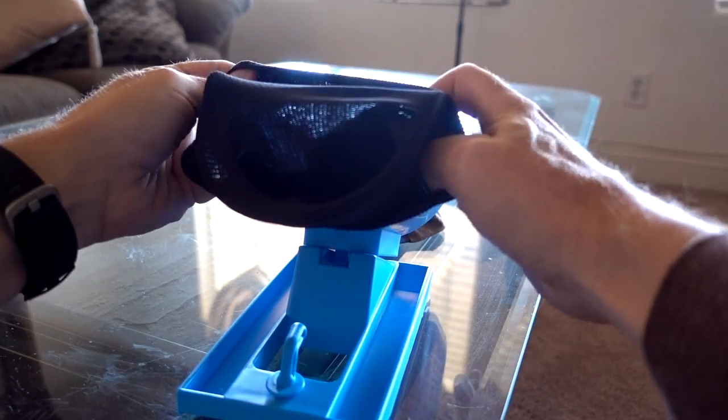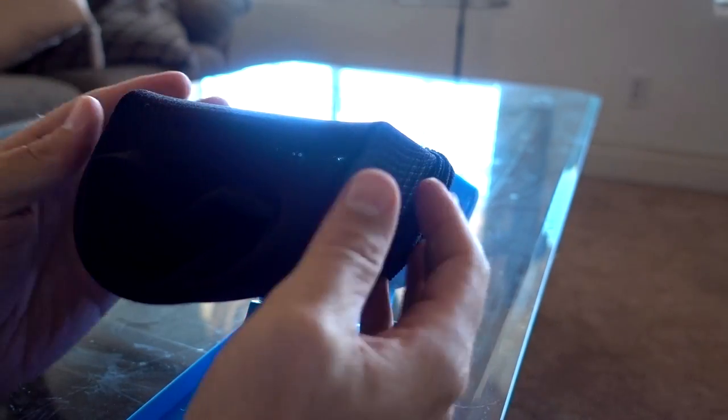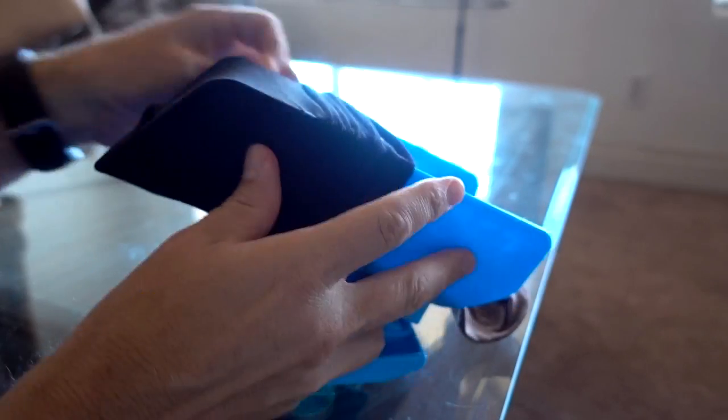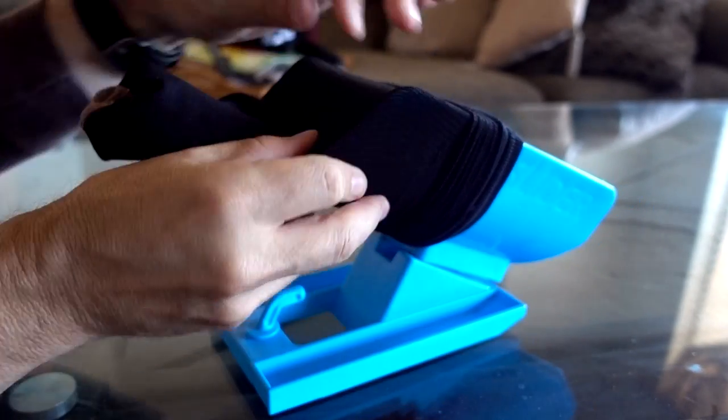The biggest test for Sock Slider would be compression socks, so I picked up a pair of Copper Fit compression socks and gave it a shot. My first attempt was kind of a fail, but by my second attempt I figured out how to make it work. These are graduated compression socks, which means they're tighter at the bottom than at the top, so as I try to put more on the Sock Slider, it gets tighter and tighter — and it's actually pressing the sides together. I'm not convinced compression socks are really feasible on the Sock Slider. It's slipping off as fast as I'm putting it on, and I still have a second one to go.